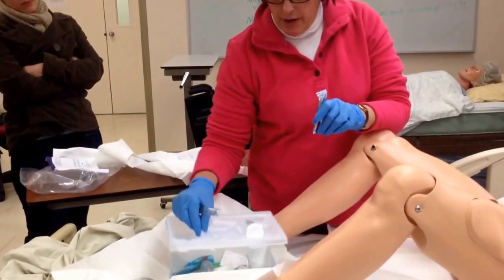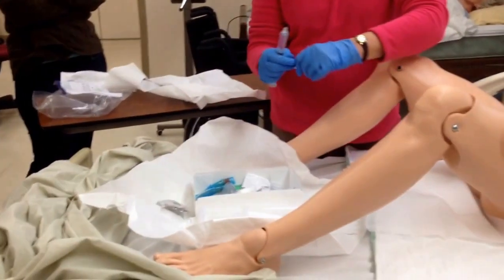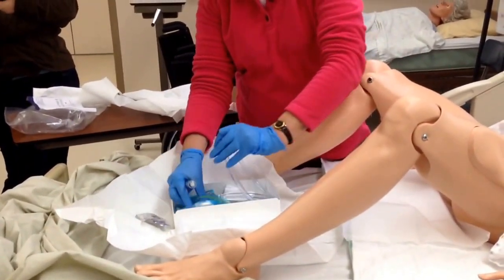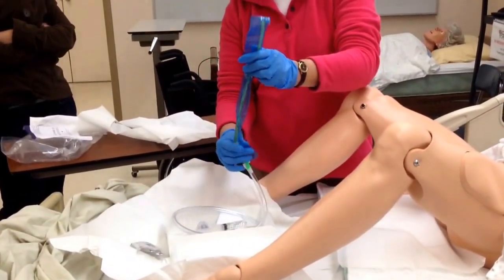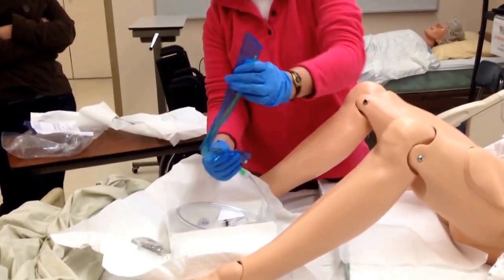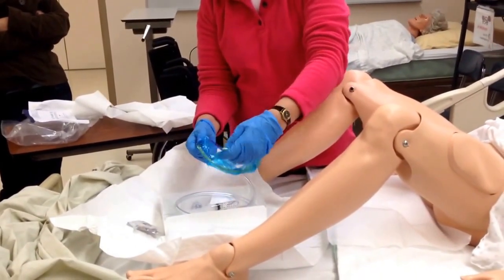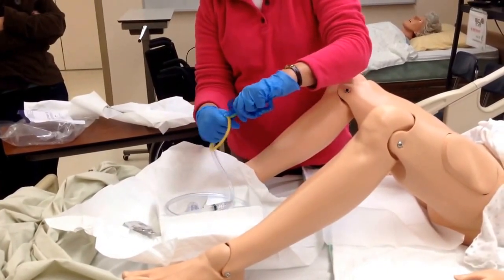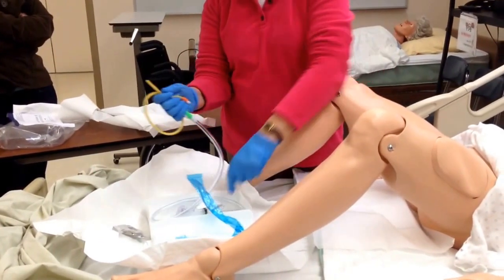So I'm just going to set this off to the side, because inside now is the kit for the actual catheter, okay? There is a sleeve that goes over the catheter. You have to remove this very carefully, and the way that I recommend that you do it is as you pull this off, you wrap it around your hand, because otherwise it's going to go flopping and it's going to hit something, okay?